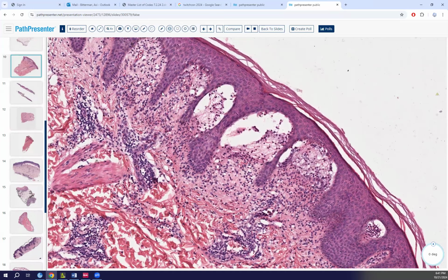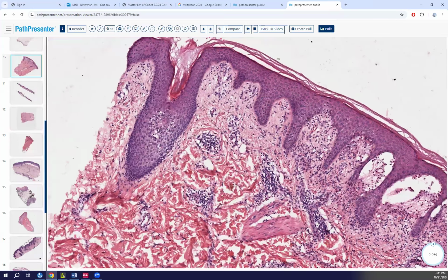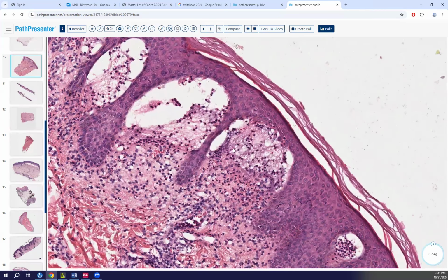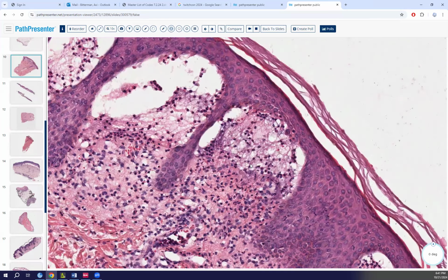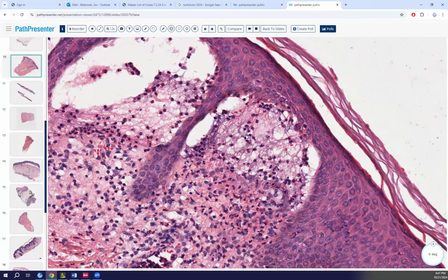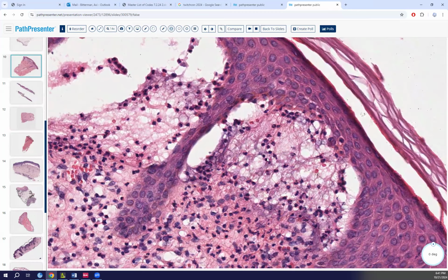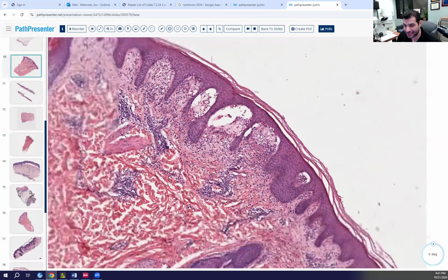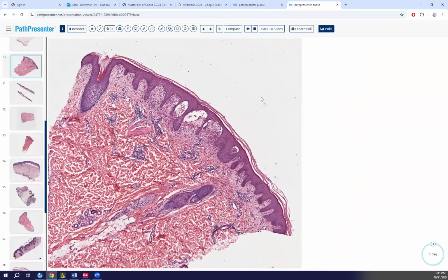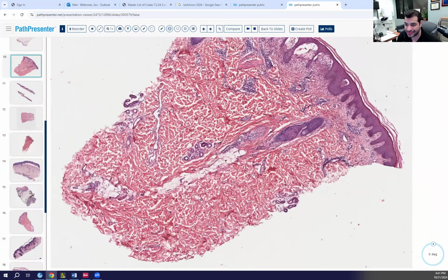I think what you might be thinking of is kind of like the dermal equivalent of acantholysis, although fibroblasts don't really have connections to each other like epidermal cells do. But I get what you're saying, like dermal papilla edema. Okay, so there's papillary dermal edema. We agree on that, yeah? Mostly it's basically superficial. There's not a lot deep going on.